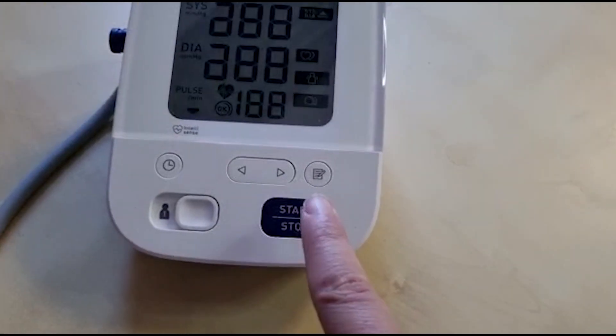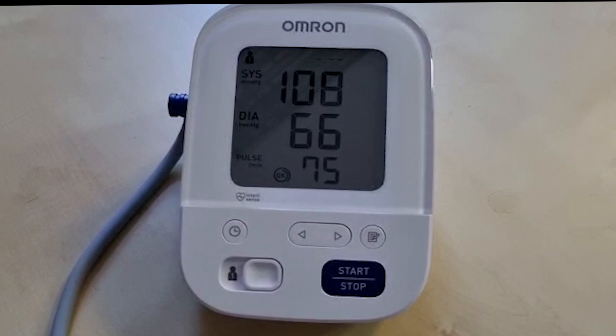Place your forearm on the table with your palm facing upwards and your arm relaxed. When you are relaxed and ready, press the start button with your opposite hand. The cuff will inflate quite quickly and you will feel a tight squeeze around your upper arm. Whilst it inflates, do not speak as it can interfere with the reading.